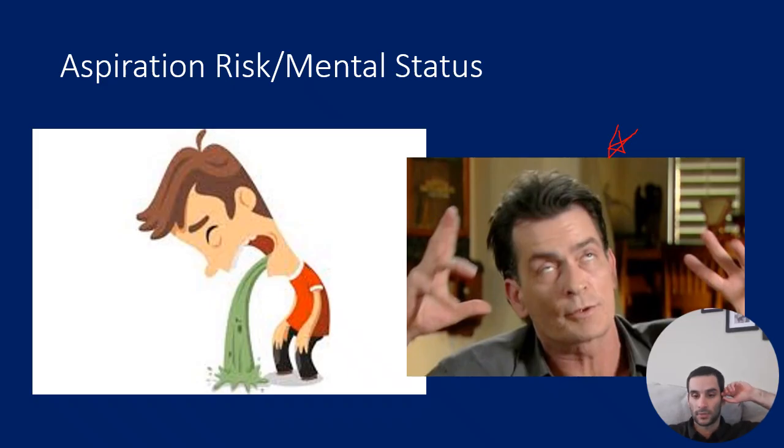However, in a true emergency, I have used this, and I think many practitioners use this in the patient who is slightly altered, because sometimes the reason they're altered is that they don't have enough oxygen or they have too much carbon dioxide. And by putting them on non-invasive, you cure the problem. They actually get better. They wake up and you avoid intubation, which is a bad outcome for them, and they end up on a ventilator, etc.